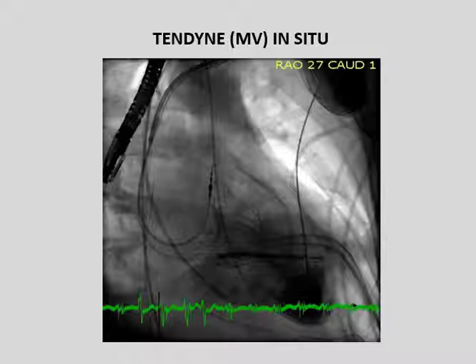In the same way that aortic valve replacements have proven very successful, we're now looking at replacing mitral valves. And this is the mitral valve we have used in the cath lab in my unit. And it's much more technically challenging in that it's not deployed percutaneously. It is actually a combination of surgical and percutaneous collaboration that allows deployment of this valve because it is deployed and anchored via a hole punched through the apex.